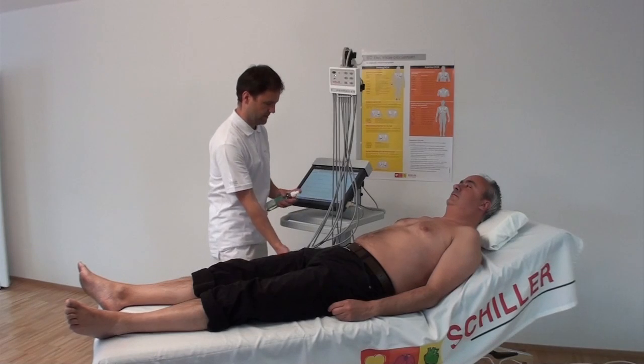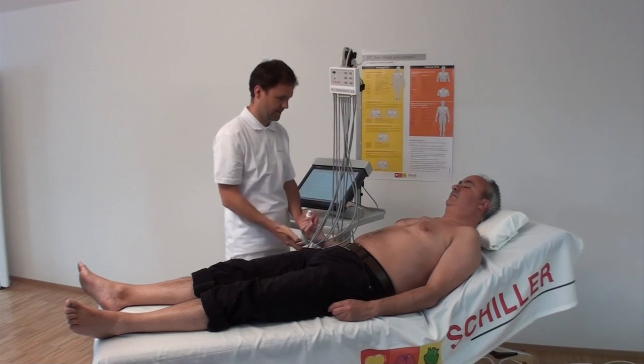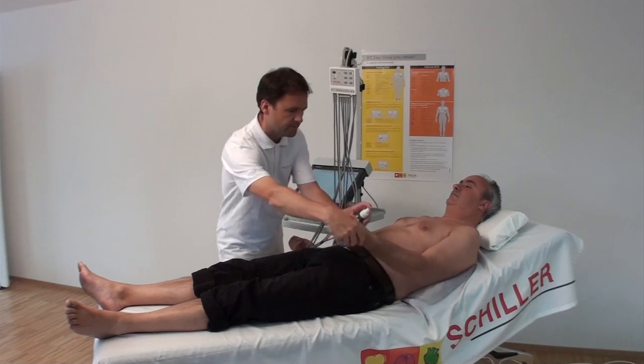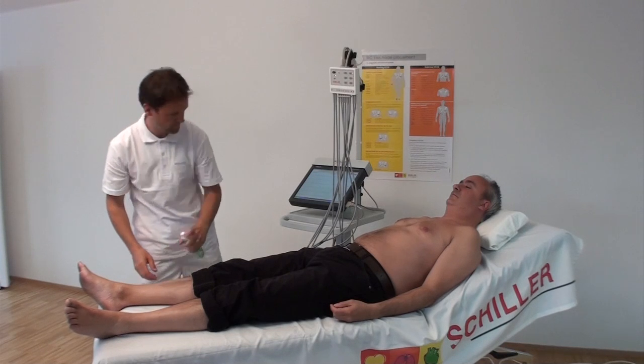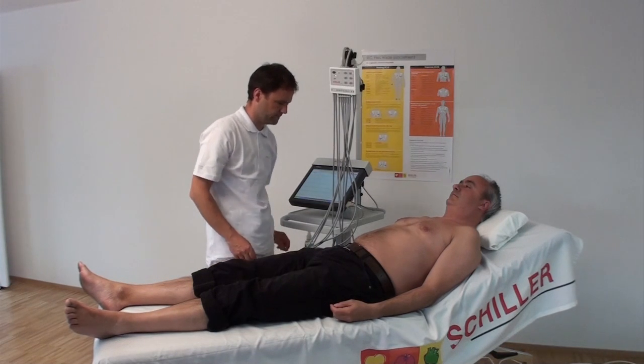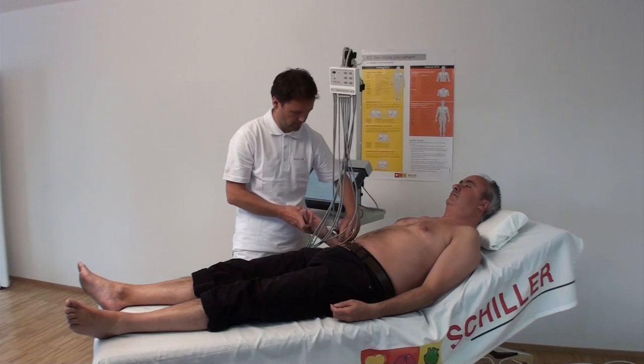Spray electrode solution on the skin locations. Select a suitable vacuum level using the buttons 1 through 6 on the patient module. Attach the electrode to the patient by pressing gently on the top of the signal modules. The electrodes will attach automatically.